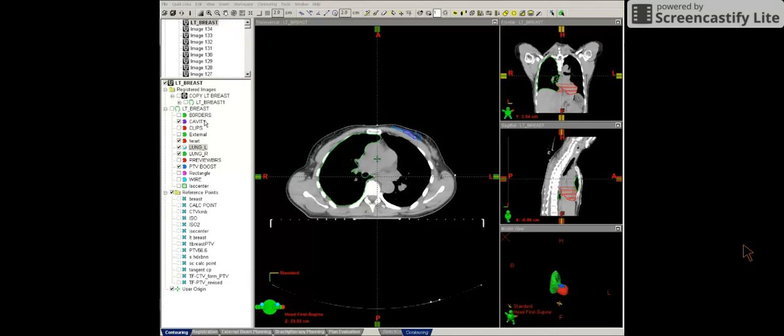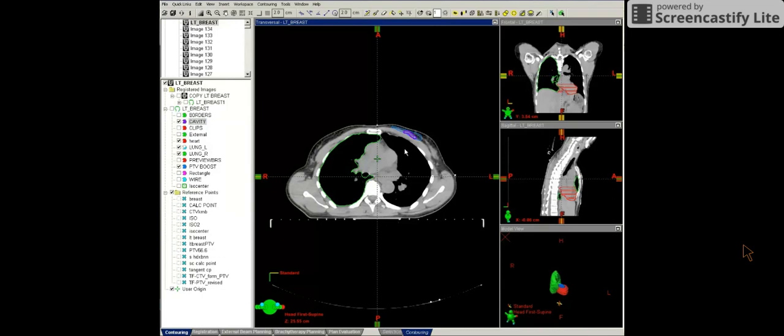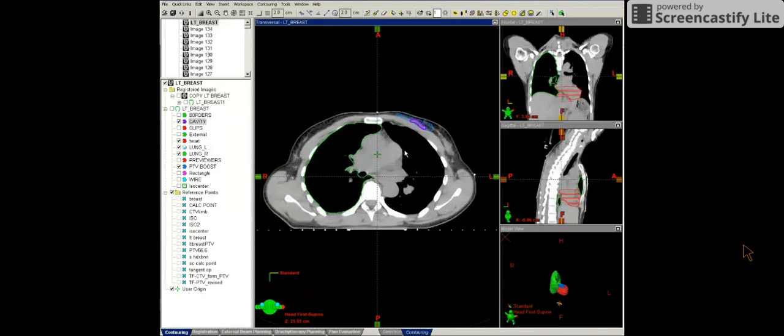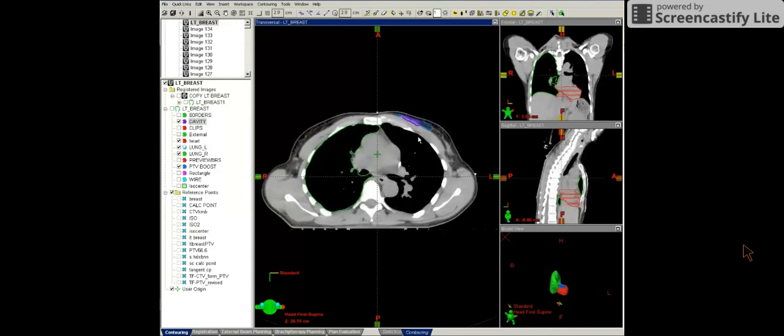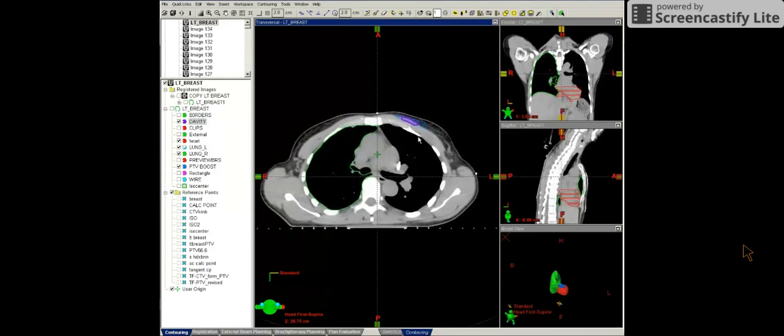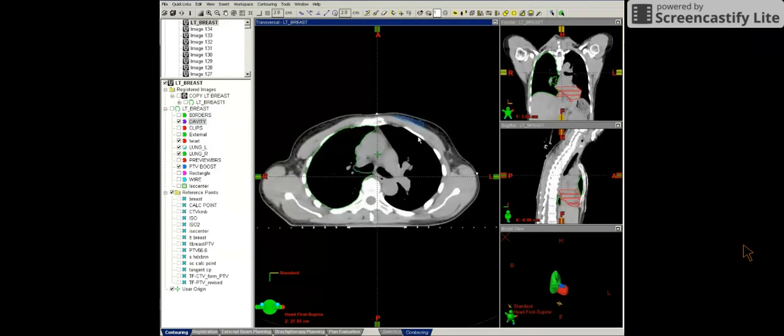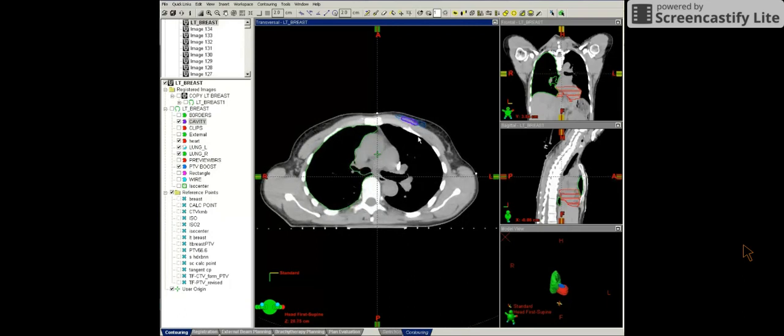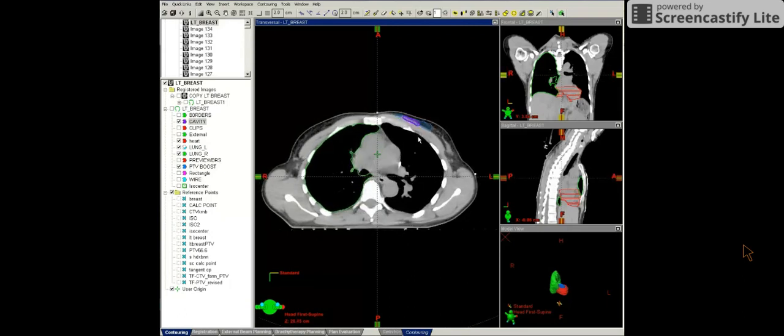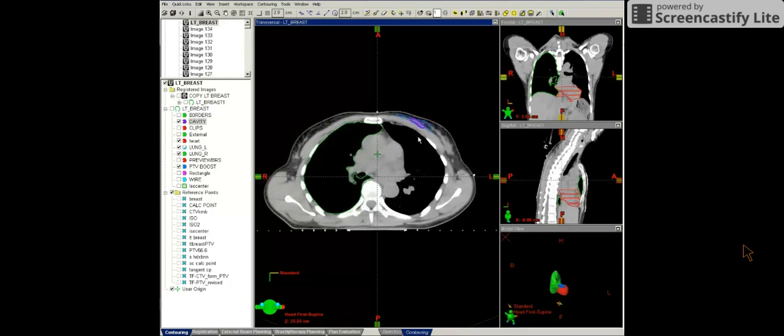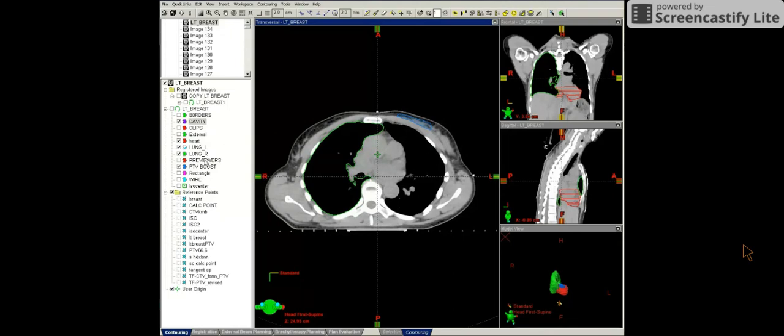We went over the borders contour in an earlier video. So let's look at the cavity. The cavity was contoured by the physician, and it's denoted here in purple. It includes the surgical clips and any gross disease remaining.